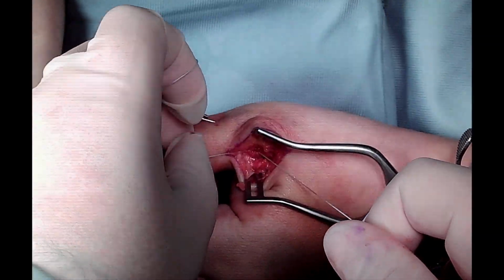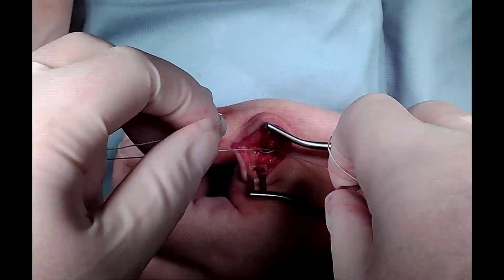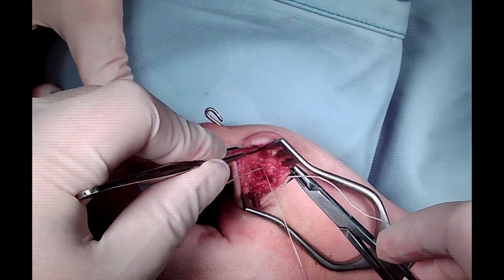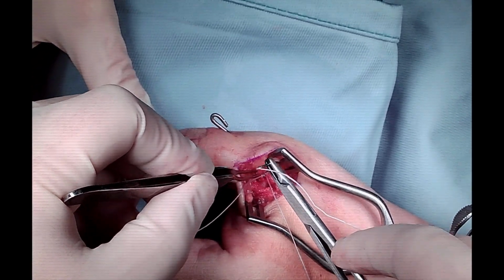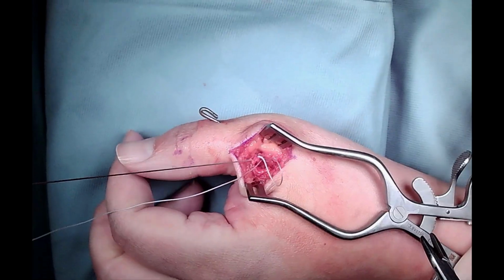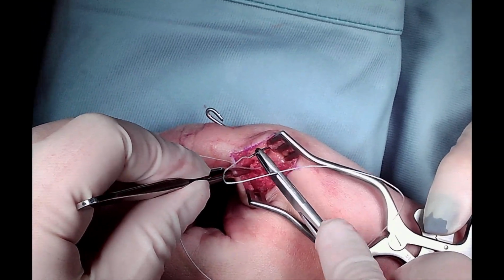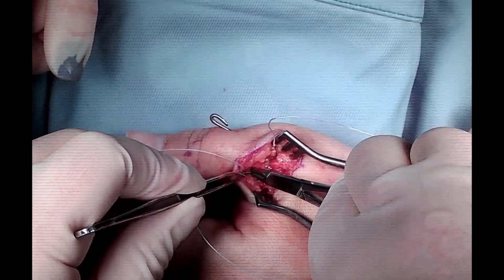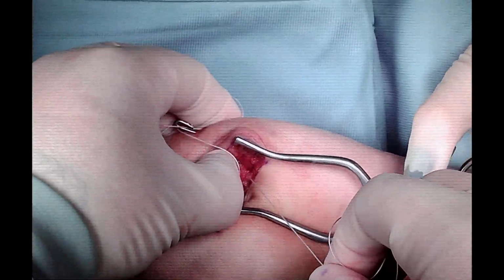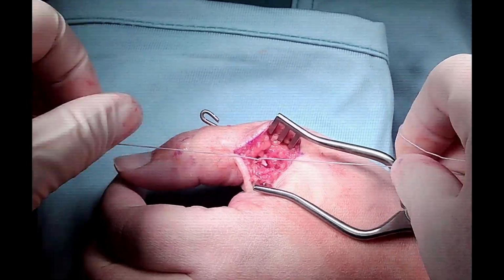Now we do the first row of suturing, of anchoring of the collateral ligament to its anatomical location, and we can augment it more with the local soft tissue. It is up to the surgeon to choose the technique that he uses for reattachment, or even choosing the anchors, as there are multiple options. This specific anchor leaves no metallics in the phalanx. It's only a suture ball that is inside the phalanx.